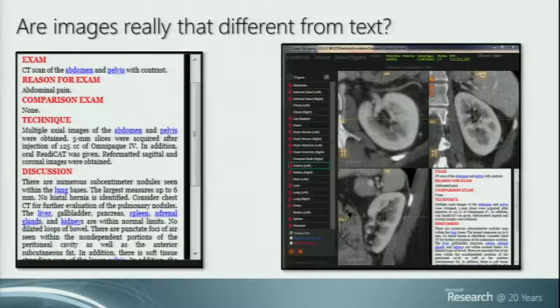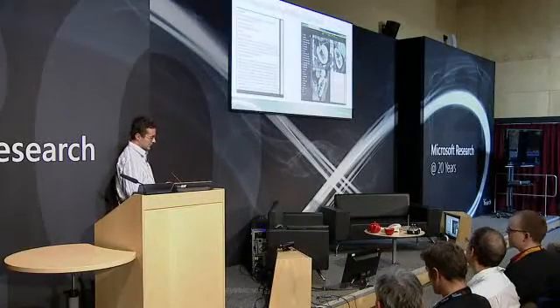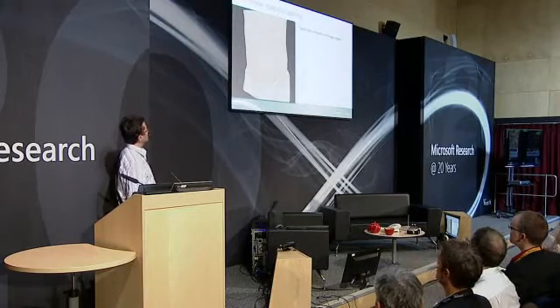So now in the Amalga application, we have both the images. In this case, we're visualizing the left kidney of the patient in this computed tomography scan and the associated radiological report. And you would have noticed that some words are highlighted in blue because they've been automatically hyperlinked. So if there is a word that says cardiac, we know automatically, of course, that that means heart. We can click on the word cardiac, and you get an optimized, zoomed-in, nicely cropped view of the heart. And the same for hepatic, which means liver, and the same for renal, which means kidneys, and so on. Again, to facilitate a very quick browsing of the patient data for both the doctors and the non-expert people.